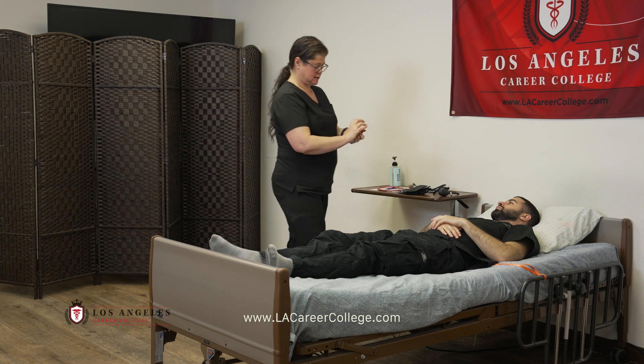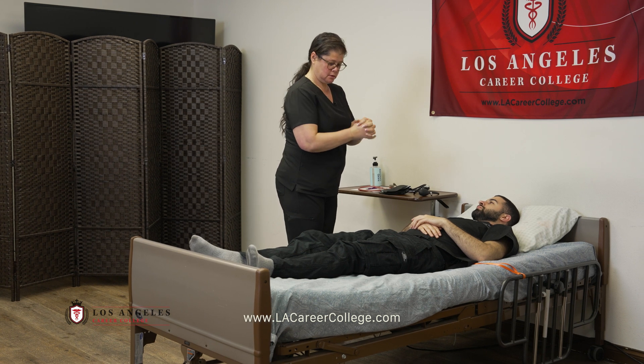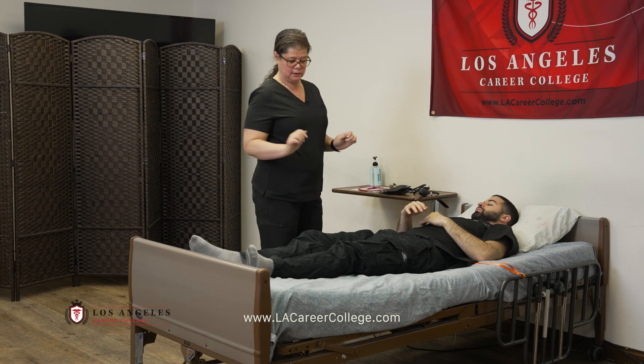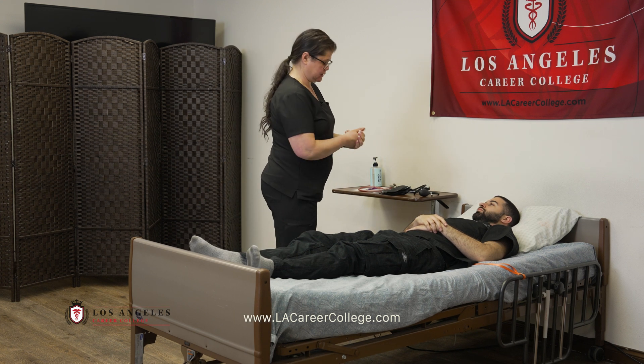Good morning, Mr. Daniel. My name is Terry. I'm going to be your CNA. Today, is now a good time to take your blood pressure? Check the ID band. The bed is low, the wheels are locked, and the call light is within reach.